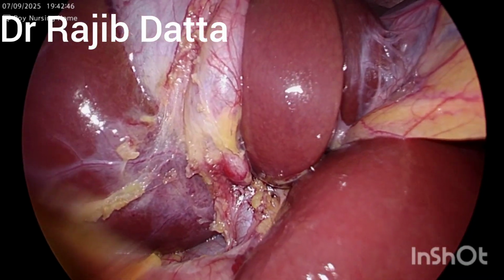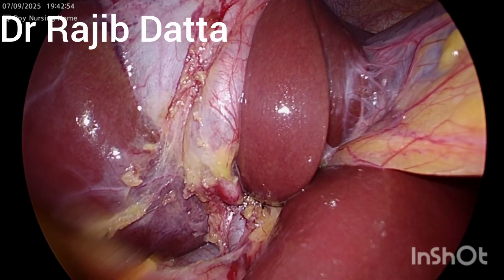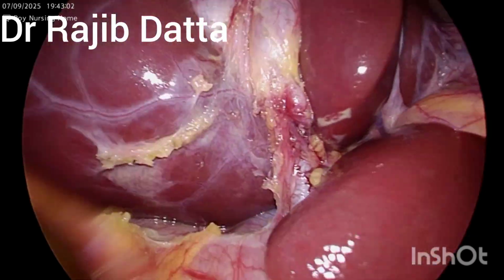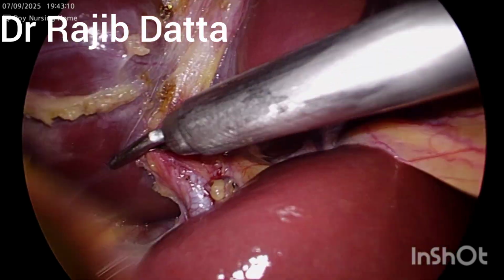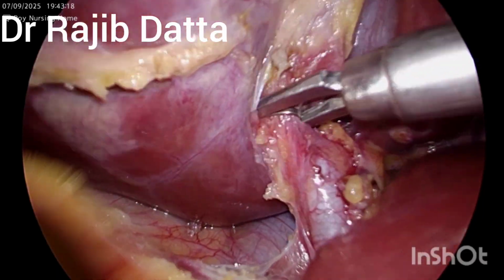Again, we are going to clip it with the help of the 300 Liga clip. So the cystic duct is clipped here.